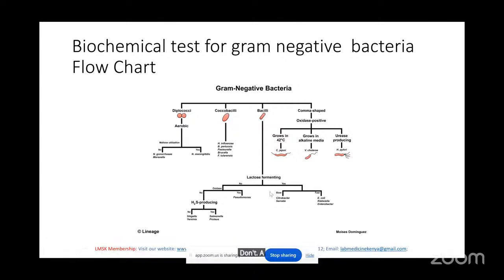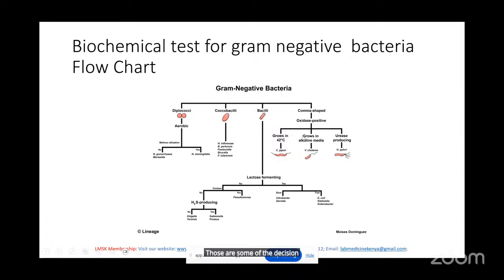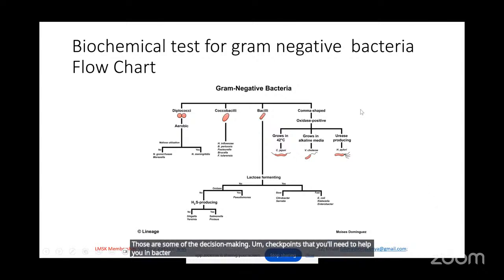Again, this is not to generalize everything. You also have to know what site my isolate is from. Is this bacteria a common pathogen in this site? So those are some of the decision-making checkpoints that you'll need to help you in bacterial identification, especially in your manual setups.